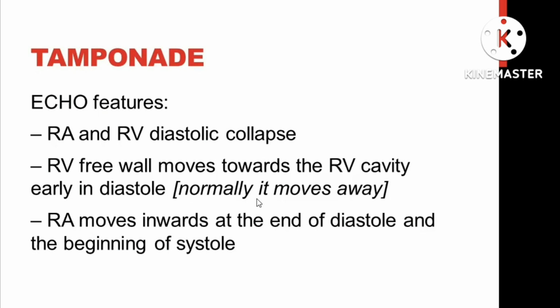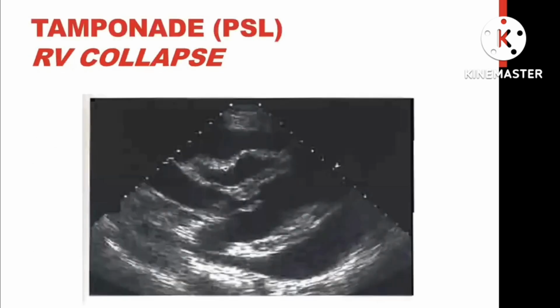So why do they call it diastolic collapse? Because during systole you expect them to collapse. So this is from an external force, they collapse. So they need to distend during diastole, but they will collapse. Good to know? So as you see here, the RV will collapse. Okay, it's like a swing. So you see here the RV is collapsing.